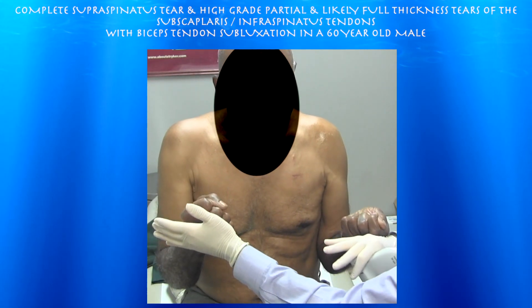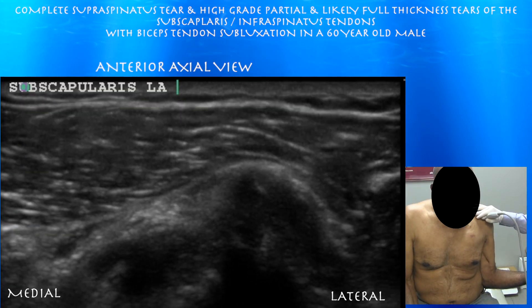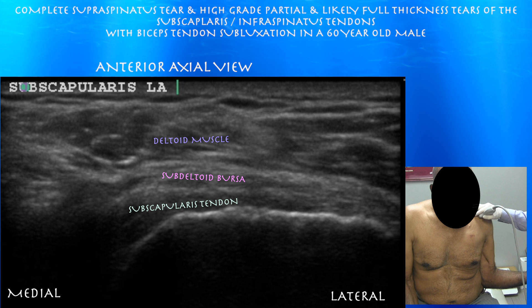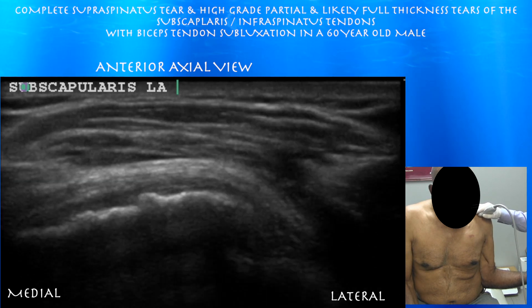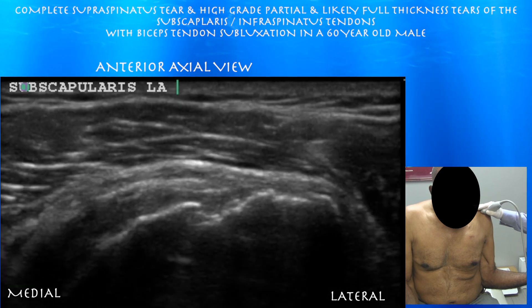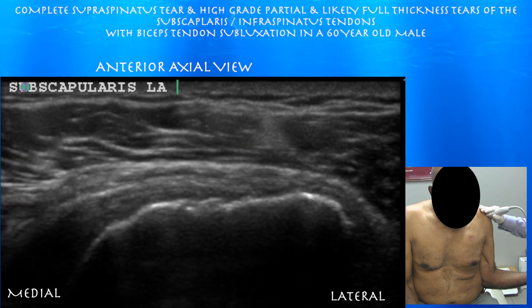Now looking at the subscapularis tendon in long axis. Left side of the screen is medial. Here's a very thin-looking subscapularis tendon, consistent with a high grade or full thickness tear of the subscapularis tendon. It looks quite thin — really not seeing much of a tendon here at all. Looks like we're just seeing some overhanging subdeltoid bursa on top of it. You can see some fibers within the subscapularis tendon region, so he does have some tendon remaining — probably full thickness but not a complete tear.